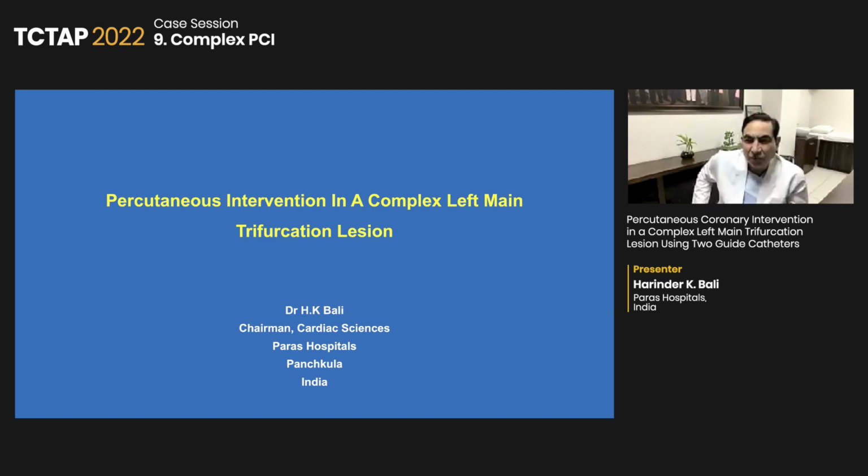Thank you. Good afternoon to all of you. I'm Dr. Harinder Bali, Chairman Cardiac Sciences, Paras Hospital, India. So, percutaneous intervention in a complex left main trifurcation lesion. We've been doing trifurcation lesions for a long period of time. Normally we need an 8 French guide catheter. So the alternative is that if we can use 2 guide catheters to take care of this trifurcation, we can make this procedure a relatively simple one.